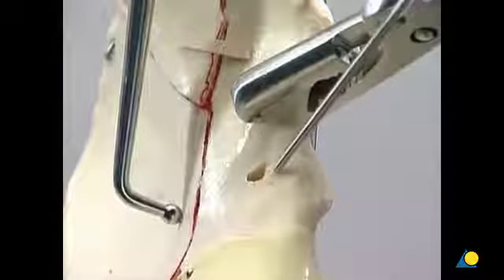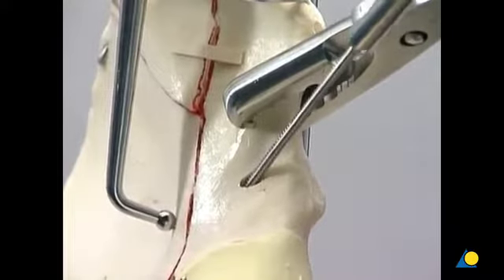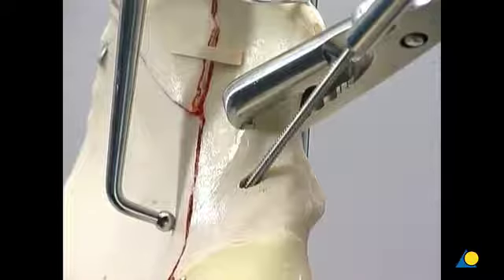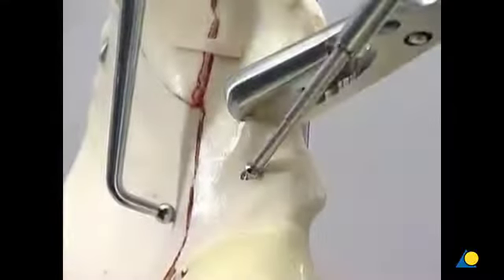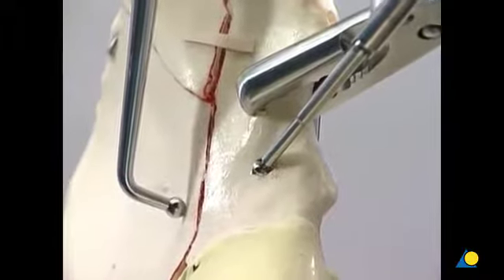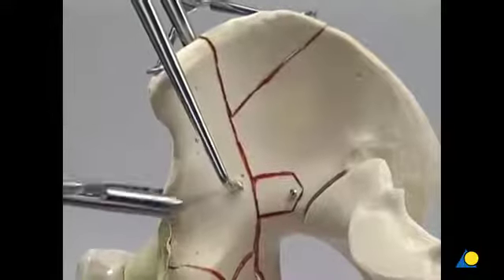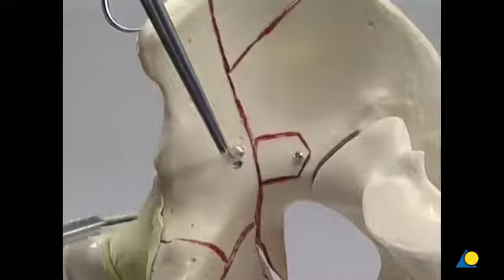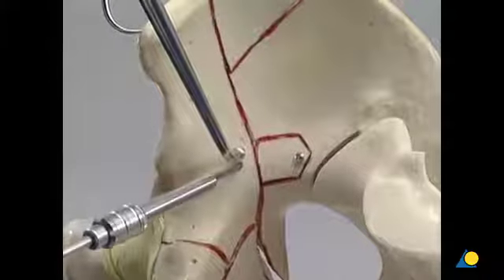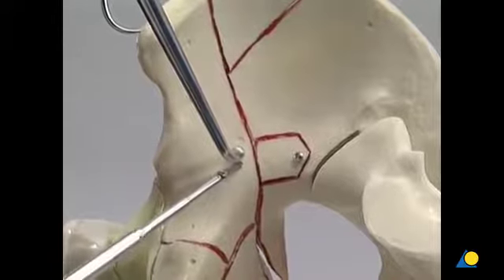The anterior column is secured to the iliac wing with a lag screw whose trajectory begins lateral to the anterior inferior iliac spine. The screw is directed into the posterior innominate bone just lateral to the sacroiliac joint. In young hard bone, where there is good screw purchase, the far cortex does not have to be perforated. The Farabeuf clamp is removed. In the next step, a short lag screw is inserted from the inner aspect of the fossa to the outer iliac wing fragment, crossing the oblique fracture line.